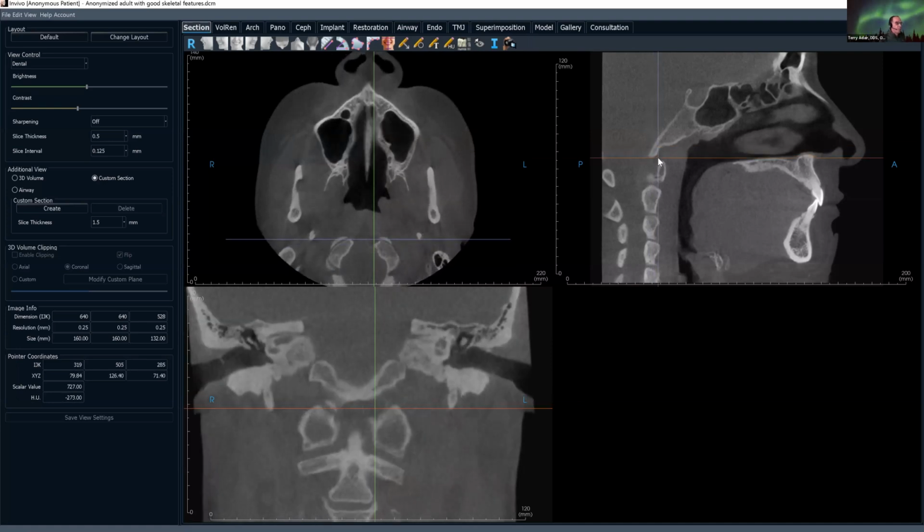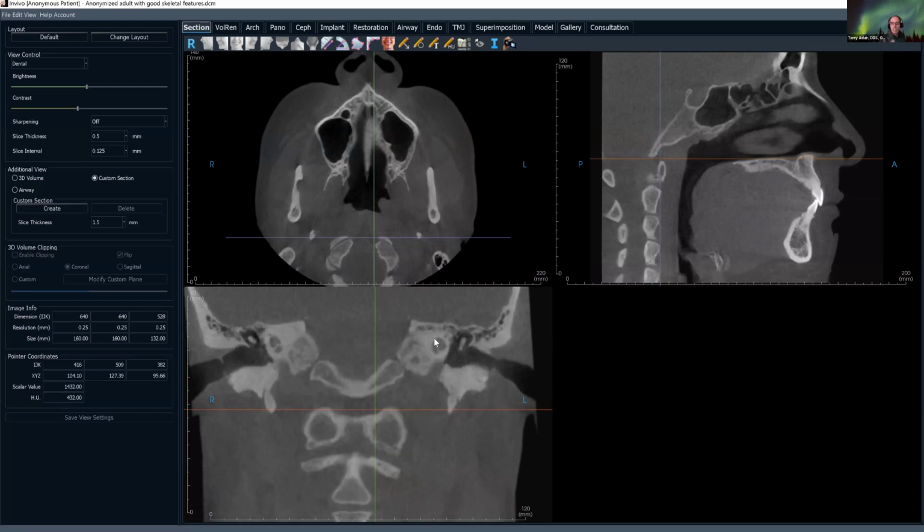So again, I backed up a little bit, but I'm scrolling through, and we see cochlea here. Cochlea is a snail-shaped organ for hearing, and it's right here. Again, this is not our area of expertise. We're looking to see if there is an asymmetry, if there is some osteolytic process happening or something happening with these structures that varies from your normal expected anatomy. And we don't necessarily have to know what any of these conditions are. Some of them we should know, and I do have a continuum on anatomy that I discuss all of those in a little bit more detail. That's not the purpose of today's presentation.